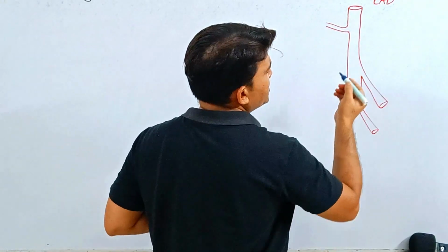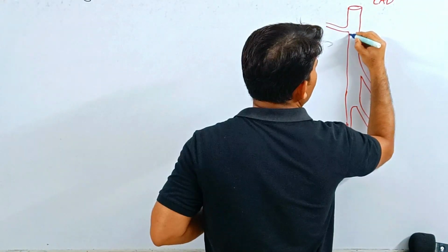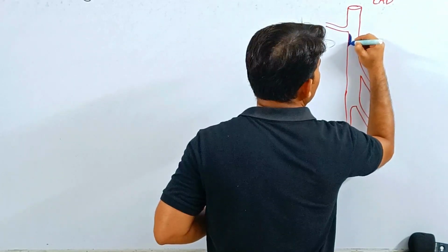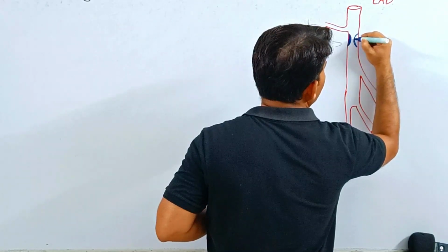So this is the clinical sign. Basically, suppose this is the LAD and it is critically occluded.